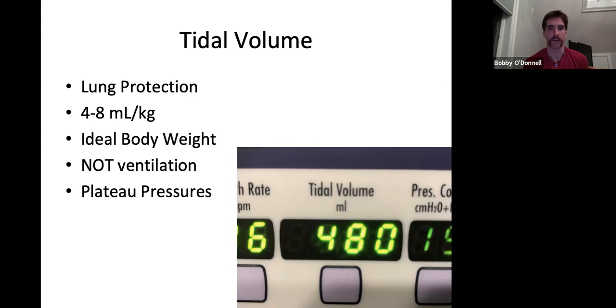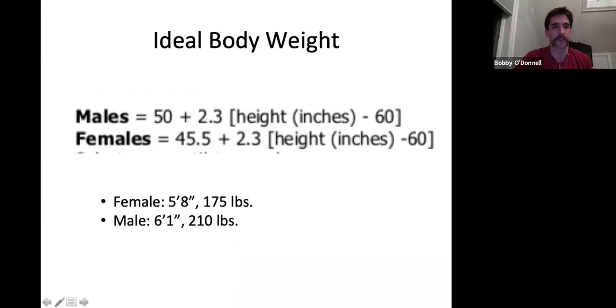And unfortunately, most of the patients that we have are going to be heavier. So it's not going to be their actual weight. It's going to be their ideal body weight. And that calculation is actually in our protocol book. And it's right here. So it's slightly different for males than females. And I can't see the chat, but I put 2 examples if you want to try to calculate the ideal body weight based off that formula.